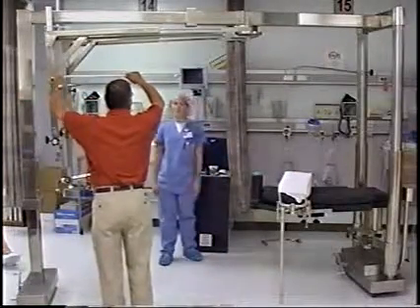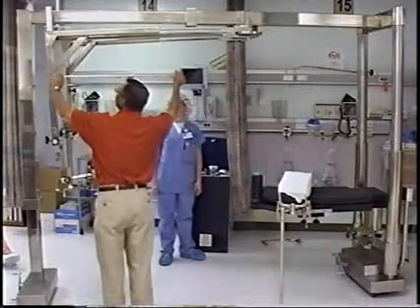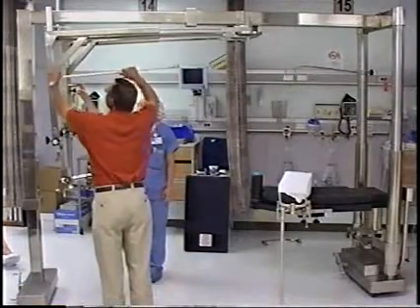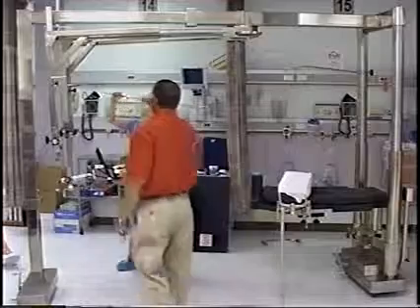And then this, of course, would go on the affected side, because on a hip, the doc is going to be operating outside the drape.